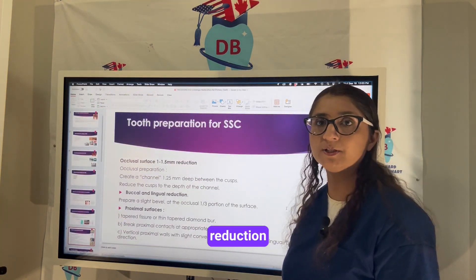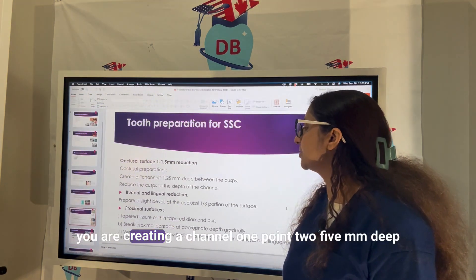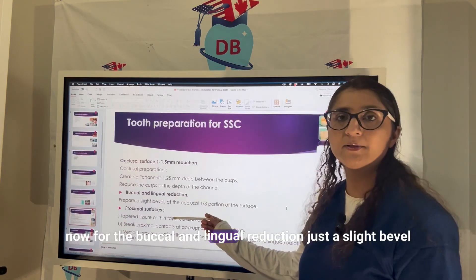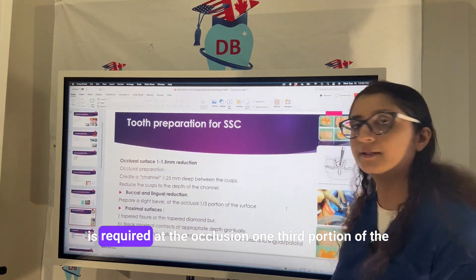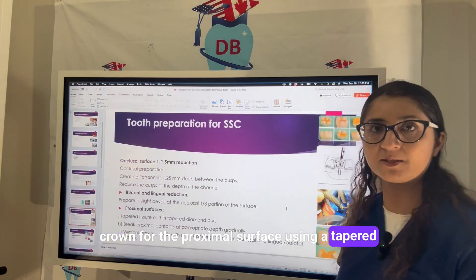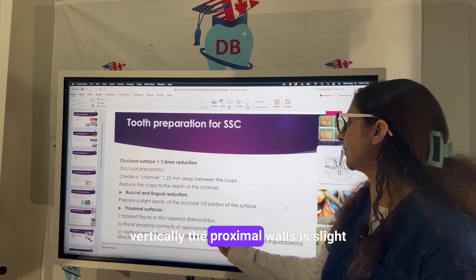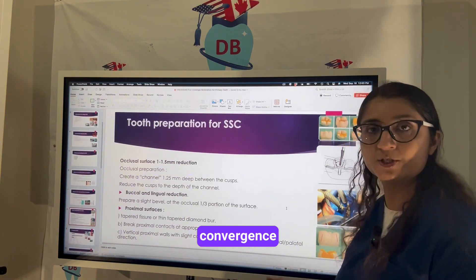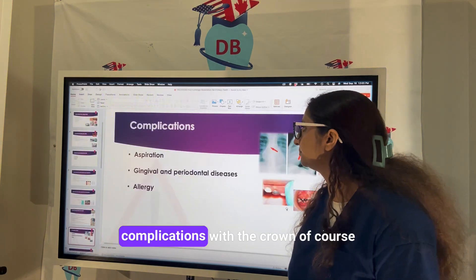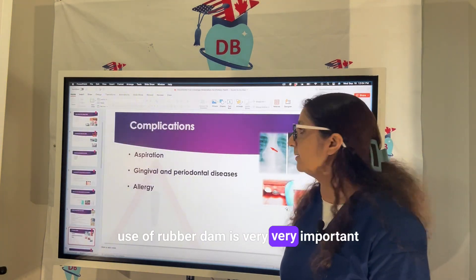For the occlusal reduction, we reduce 1 to 1.5 mm, creating a channel 1.25 mm deep between the cusps. For buccal and lingual reduction, only a slight bevel is required at the occlusal one-third of the crown. For the proximal surface, using a tapered fissure thin diamond bur, we break the proximal contact vertically; the proximal wall with slight convergence can be used in occlusal, lingual, or palatal direction.